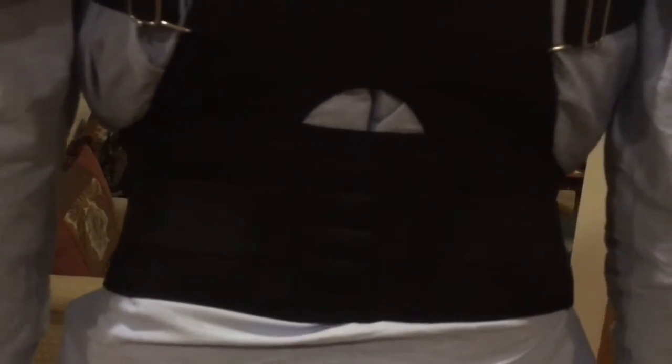Here's a close-up of the back — you can see the padding and stitching that really help your body get used to this without it being flimsy or thin, which is the kind of material that would cut into your clothing. You can also see the metal adjusters on either side of the waist, which is where you control the tightness and how far back it goes.